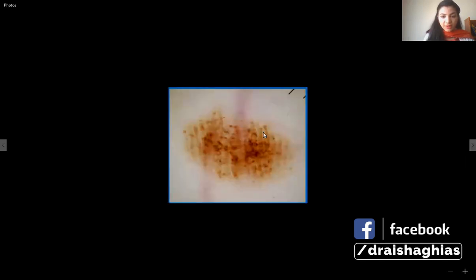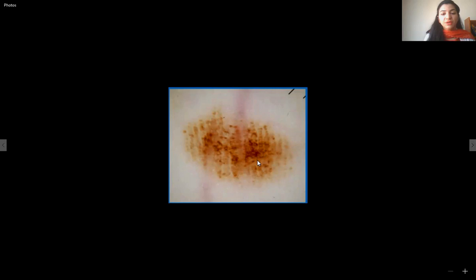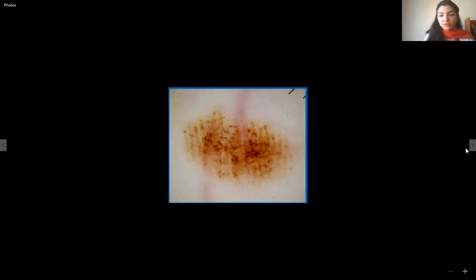The next one is skin of either a palm or sole because it is showing the ridge pattern. The pigment is concentrated on the ridges rather than the furrows. If pigment were more in the furrows it would be a normal pattern, as seen in solar lentigo or a common melanocytic nevus. However, the lesion does not appear symmetrical, the pigment is concentrated on the ridges, and the furrows appear as depigmented lines only — the thickness of pigment is more compared to the white line. This is called a parallel ridge pattern (PRP), and it is diagnostic of acral melanoma. Isolated dots and clods and some chaos are also visible. This is an acral melanoma.